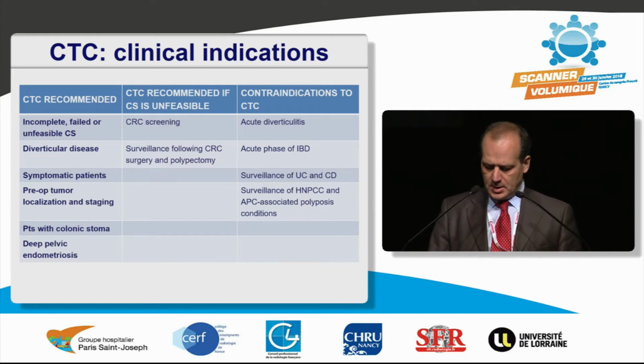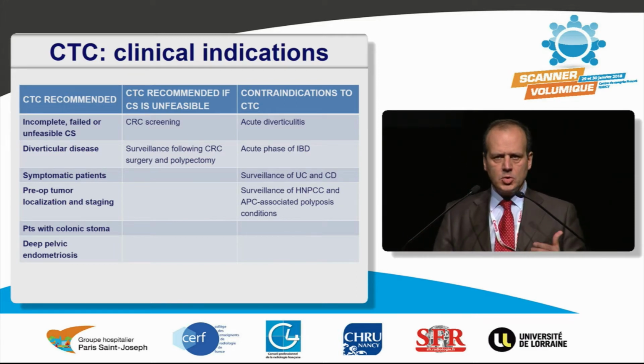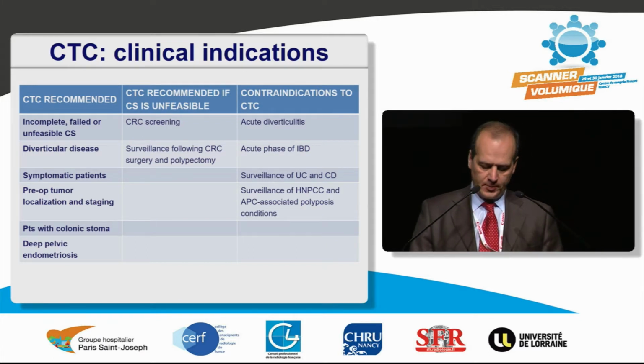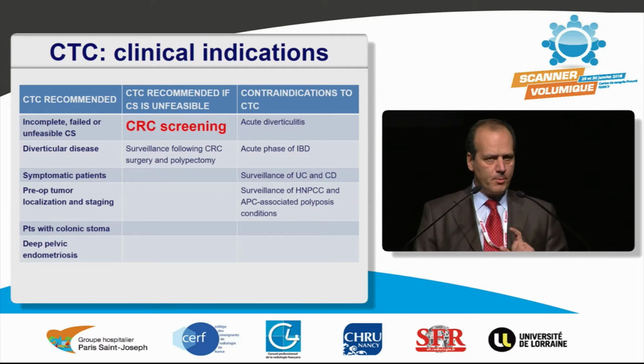I don't want to discuss all of them. The indications on the left side are the indications that we agree with the endoscopists that they should refer patients to us for a CT colonography. Today I want to discuss with you only colorectal cancer screening, the population screening.